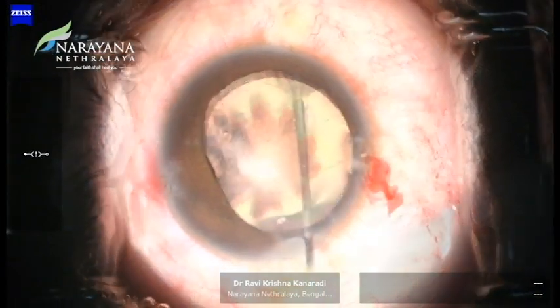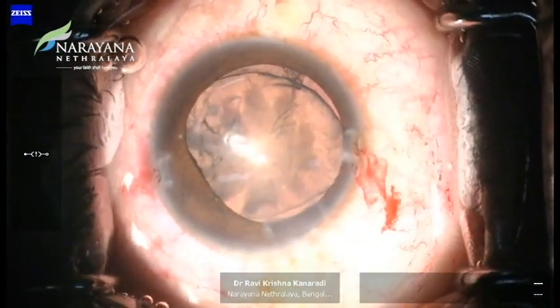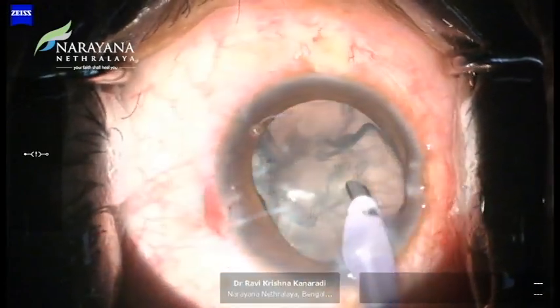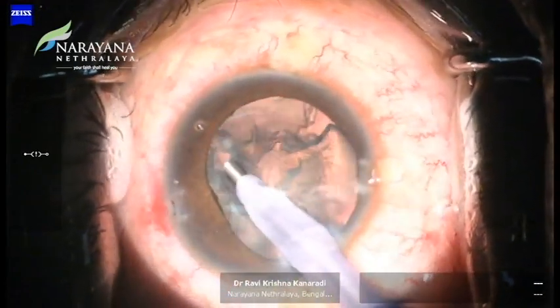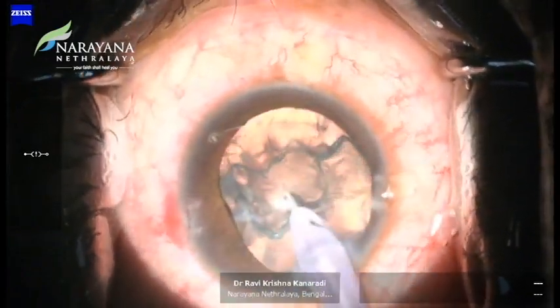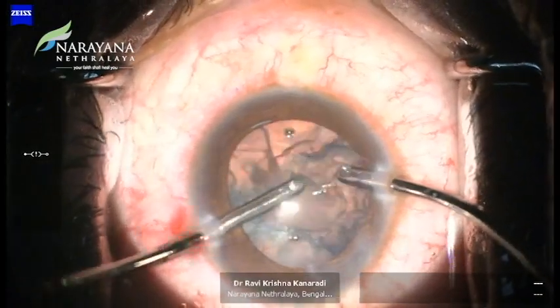The forceps should be repeatedly released and then re-grasped in order to have precise control of the tear direction. Hydrodissection was completed thoroughly. Phacoemulsification is now performed at lower parameters and the soft cataract is completely aspirated.